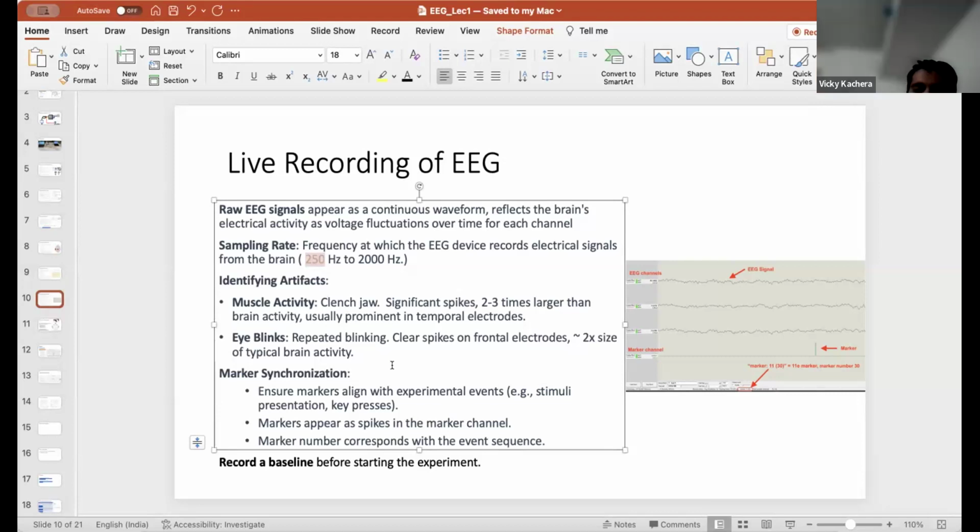So do we set it ourselves, or it is there by default? There is a default number there that should be set already in the recorder. In our case, it will be set in the recorder. But you can change it. You have the freedom to change it. In most cases, we record at high frequency, and then after filtering we downsample it, because we don't need 2000 samples per second for most of our analysis. Okay. We downsample it, but after pre-processing.